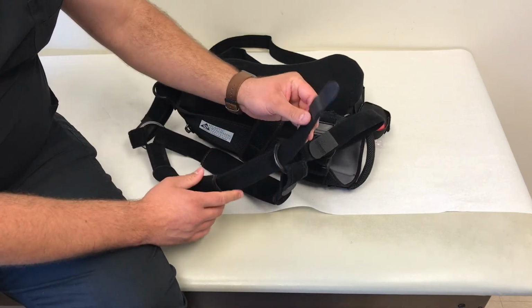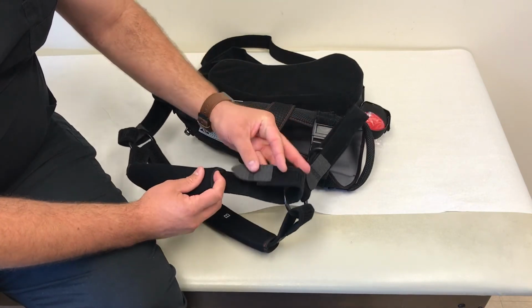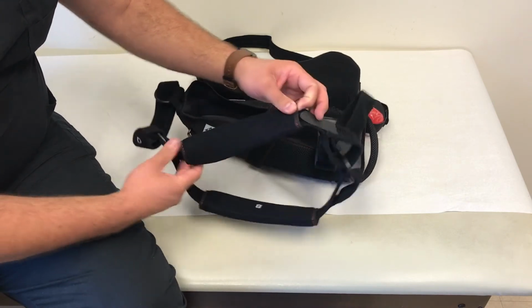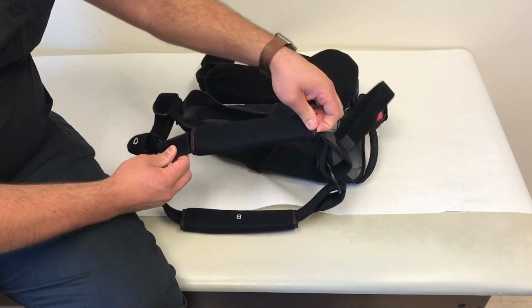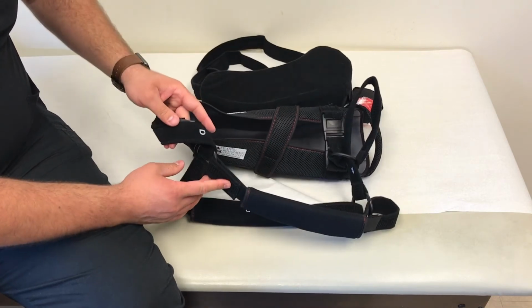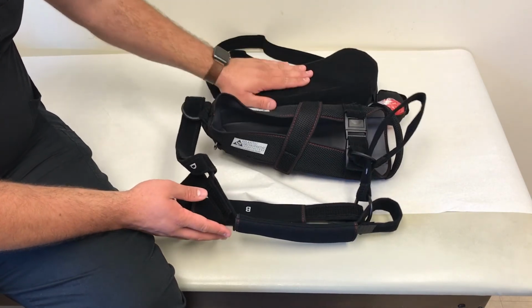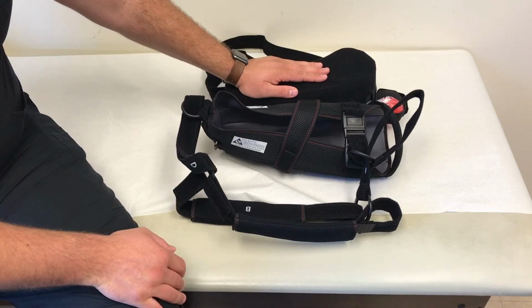You can go ahead and remove the end of it and readjust it, and then reapply, just like that, sliding the shoulder padding back over. And you can do that all the way through strap D as well. That's pretty much the anatomy of the DonJoy Ultra Sling IV.